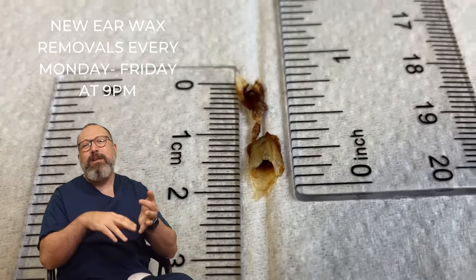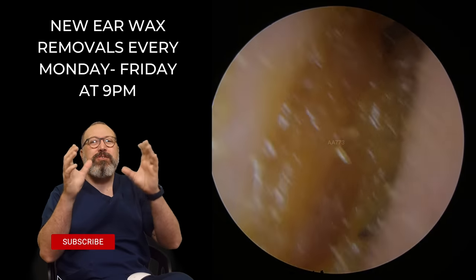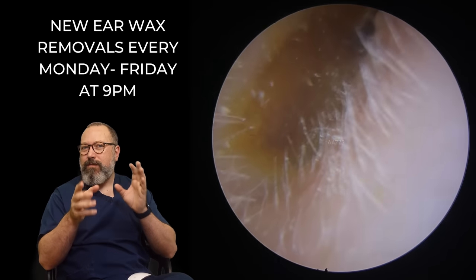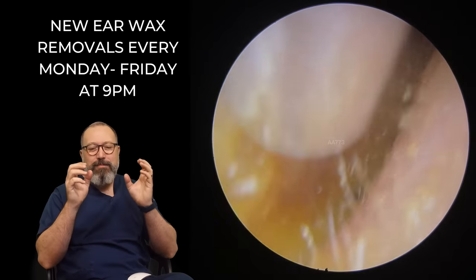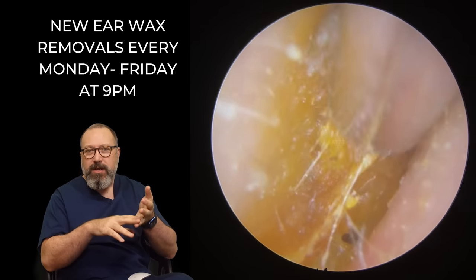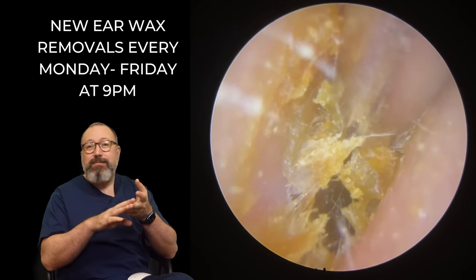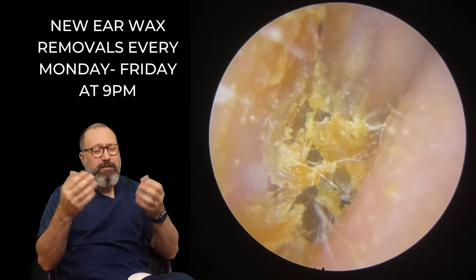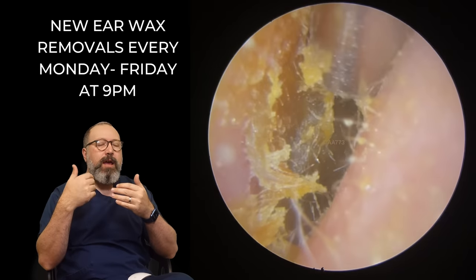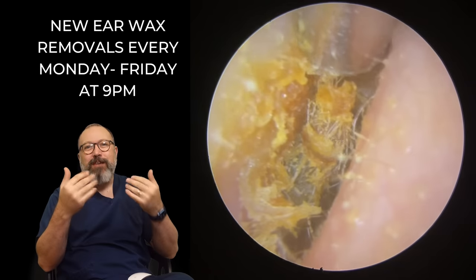As for the mastoid, a couple of people asked whether what you see is the cartilaginous portion of the ear canal. It's mostly bone, to be honest — you do see the cartilaginous portion at the outermost part. A couple of people asked about the sort of fuzzy layer — well spotted. A couple of you thought it might be a fungal infection, but it's not. The reason I know is that when somebody has a mastoid operation, or even a perforated eardrum or grommets, they're always advised to keep their ears nice and dry. The most common way here in the UK is to get some cotton wool — you call it something different in the US — coat it in Vaseline and pop that inside the ear canal when you have a bath or shower, so the water runs off the Vaseline. What you're actually seeing in the ear canal is not a fungal infection — you're seeing remnants of cotton wool that have stuck to the surface layer of skin on the outermost edge of that mastoid cavity.